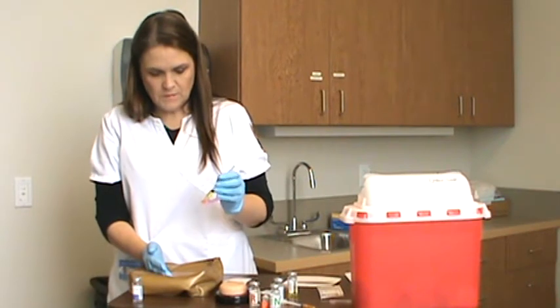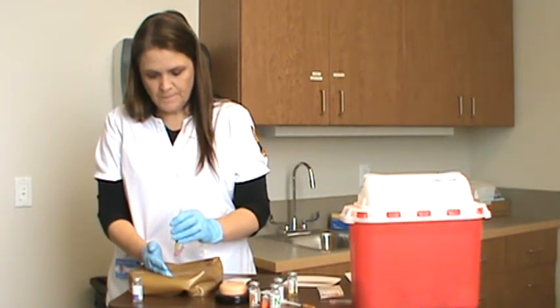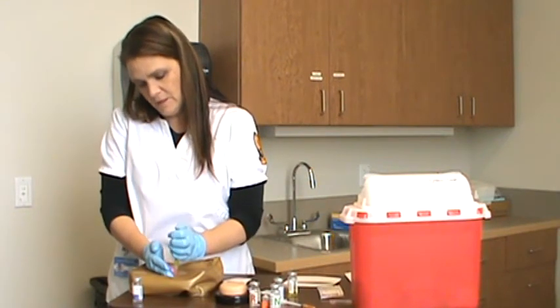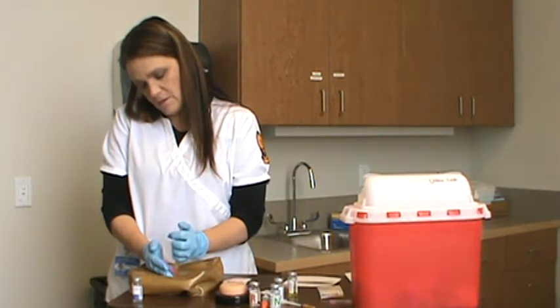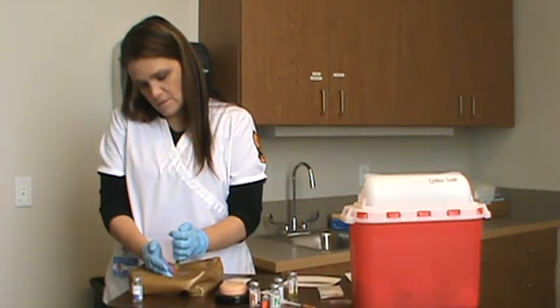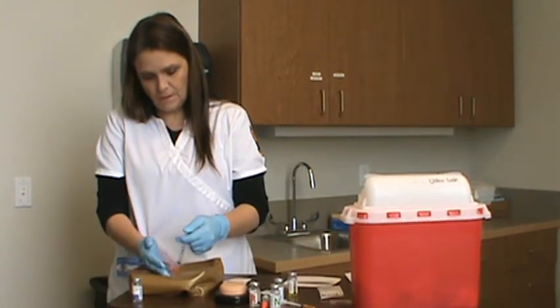Pull back. This one you can give at a 90 as well, straight down. Then pull back up to make sure that there's no blood. There isn't, so then you can just give the shot, and hold. And you're done.